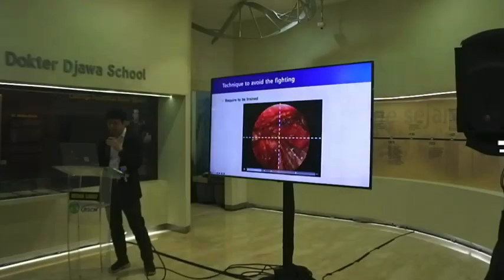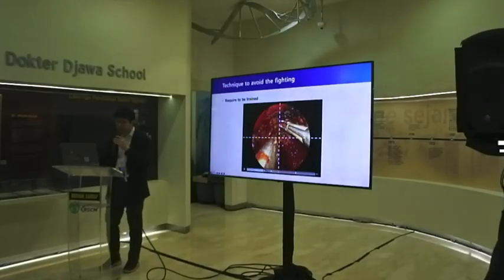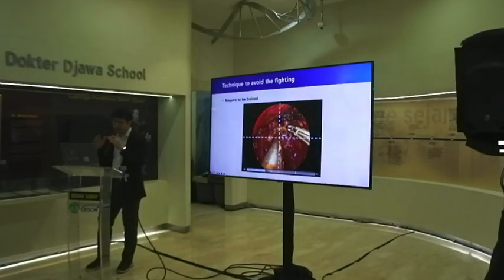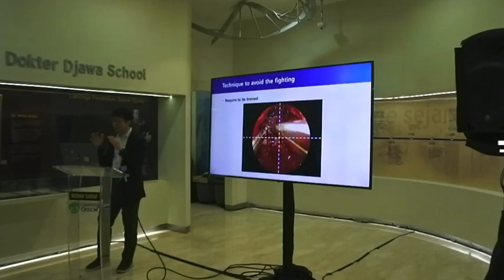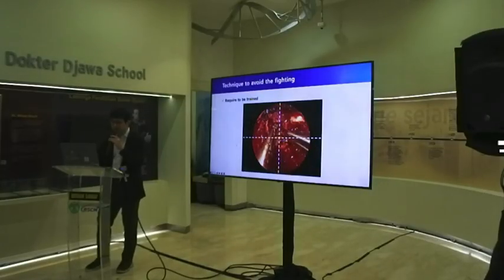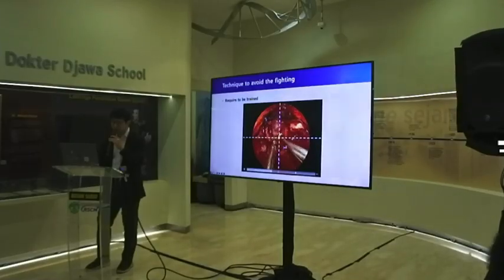And this is how to use the punch. As Professor Kim told us yesterday in the neurosurgeon demonstration, when the cavernous sinus or the blue line shows up in the field, don't twist the punch. You may cause some venous bleeding. And this case is a meningioma, and that's how to handle the instrument like this.